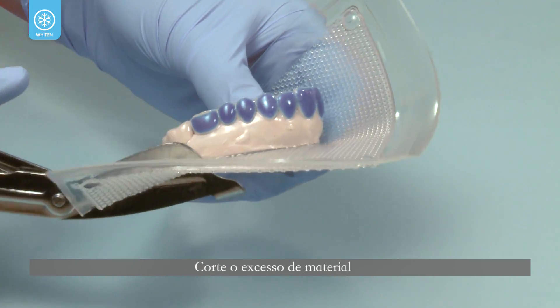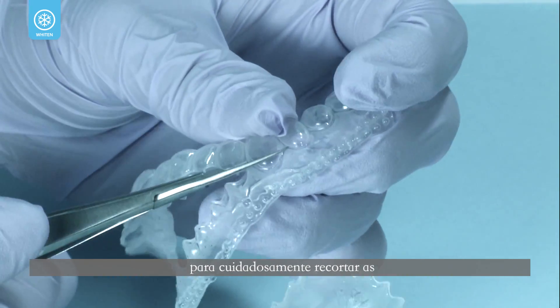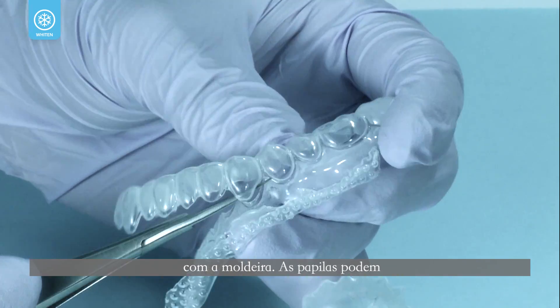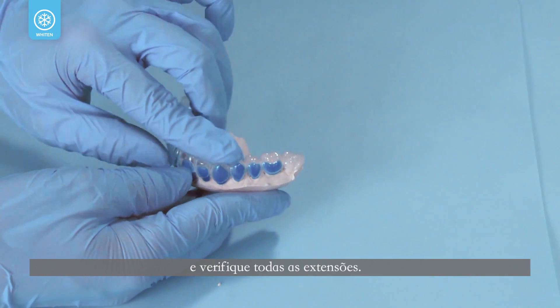Cut the excess bulk of material away with Ultradent Utility Vinyl Cutters. Use ultra-trim scalloping scissors to carefully scalp the gingival embrasures to prevent covering the gingival papillae with the tray. The papillae may become sore and irritated if the tray covers them. Return the tray to the model and check all tray extensions.